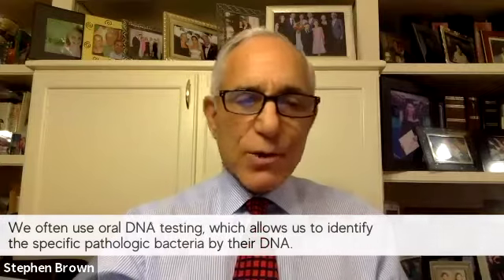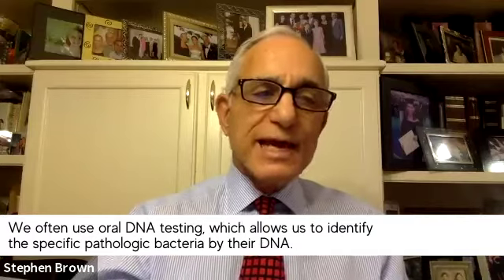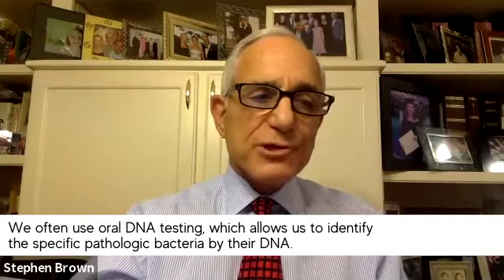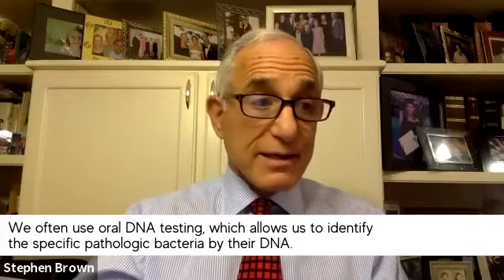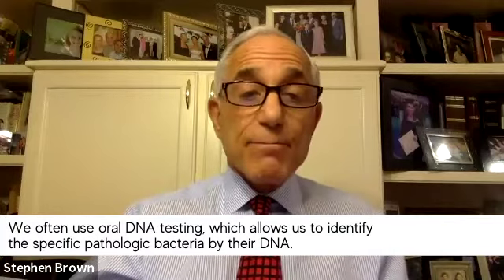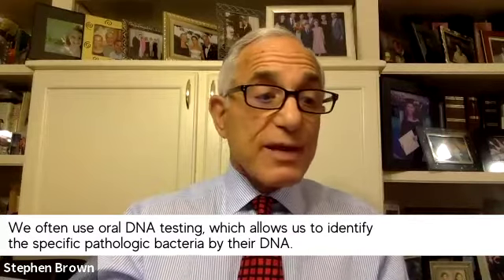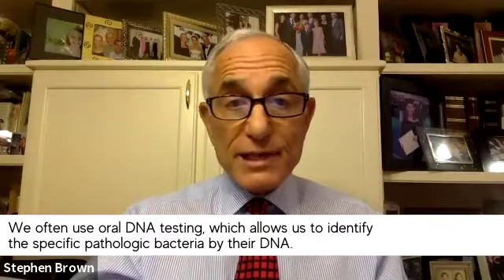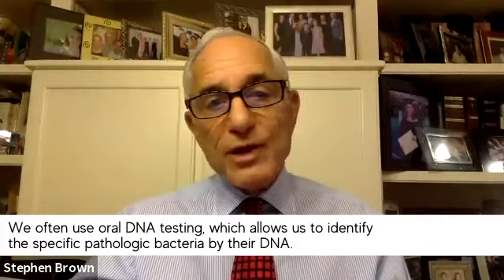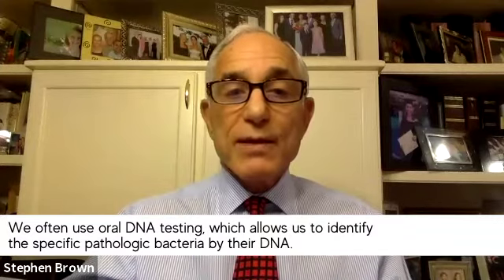Yeah, Jody, that's a great question. So in addition to the microscope, we often use oral DNA testing. Basically, that identifies the specific pathologic bacteria by their DNA. It's an early warning sign. It permits us to develop a very personalized treatment plan specifically tailored to eliminate the periopathogenic bacteria. In other words, in layman's terms, if we can know who the enemy is, we know what tools we have to implement getting rid of them.